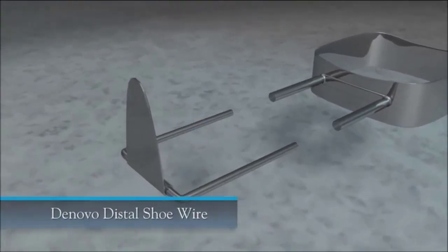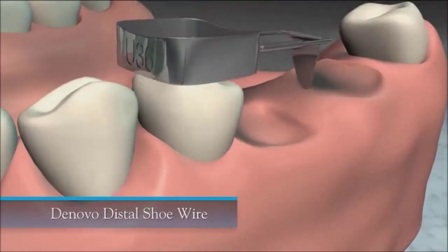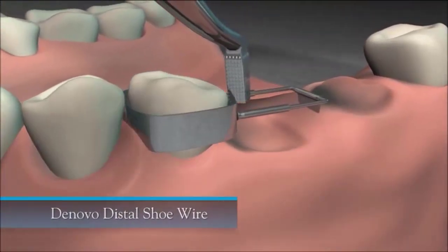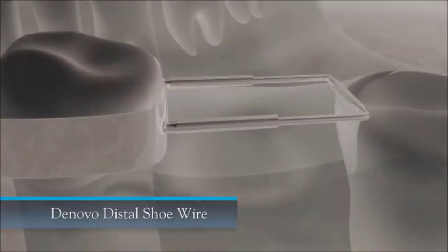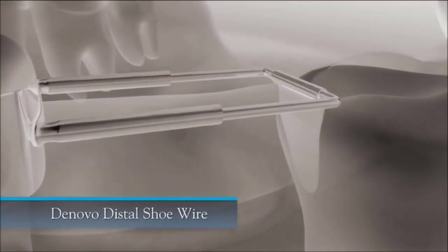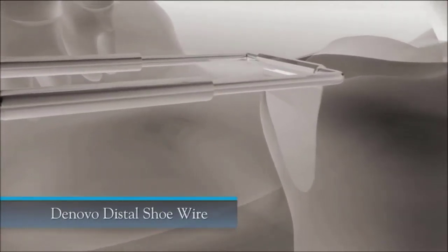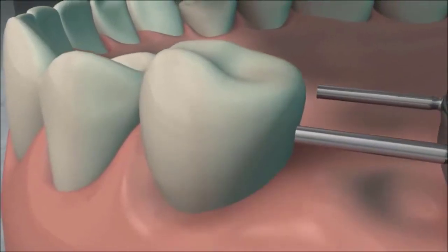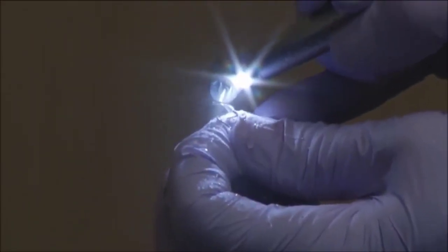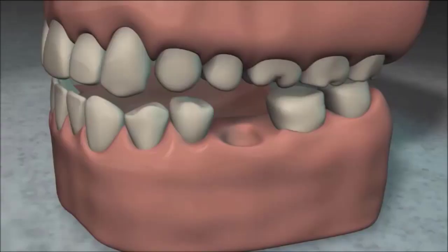The distal shoe wire is used when the first permanent molar has not erupted and the patient has prematurely lost the second primary molar. Place the band on the first primary molar with the distal shoe blade pointing toward the gingival tissue, and place the blade subgingivally sliding down the pre-erupted permanent molar. Take an x-ray to confirm proper placement. Place the wire on the mesial of wherever the first permanent tooth is beginning to form — the distal shoe will prevent the permanent molar from tilting into the space. If the tubes are too long, cut them using a double-sided diamond disc burr with a slow-speed handpiece.